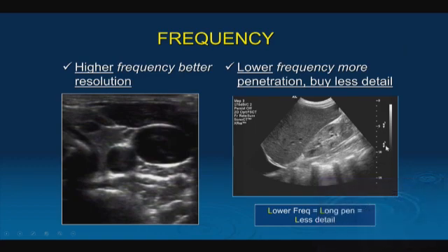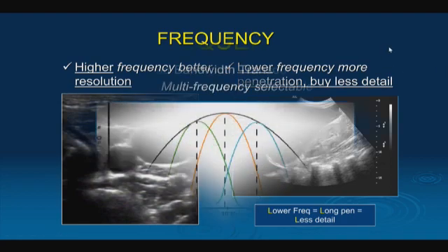So I tell people just to keep in mind the 3 L's. Lower frequency equals longer penetration but less detail. You're going to have to give up something to get something else.